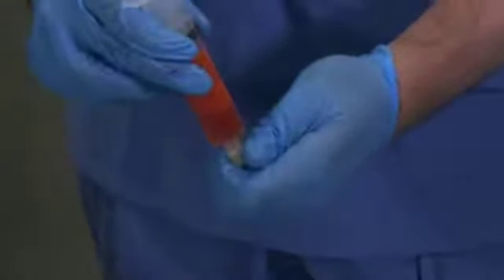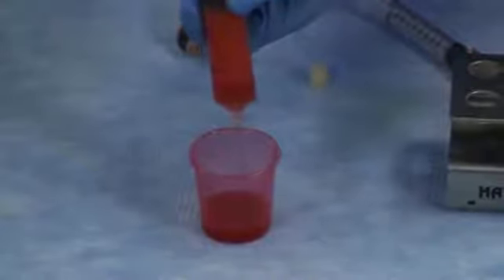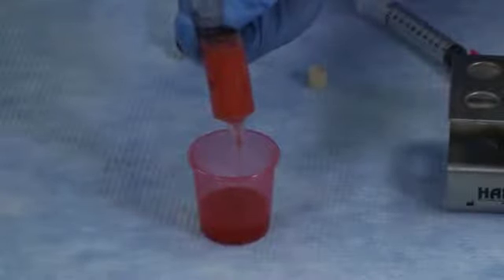Once each sample has settled, expel the separated wash solution out of each wash syringe into disposable cups. Be careful not to expel any of the adipose tissue. The samples are now ready for transfer to the AdiPrep disposable for processing.